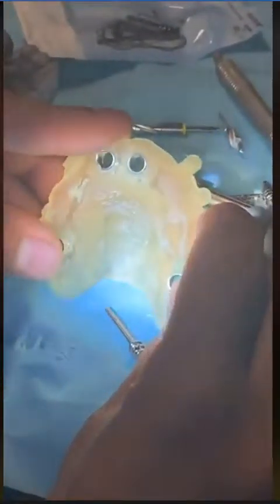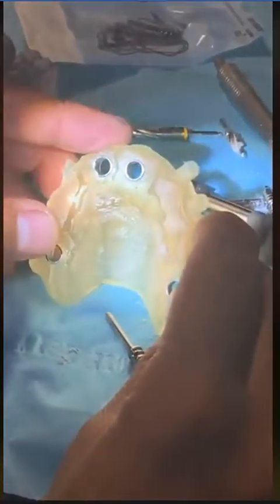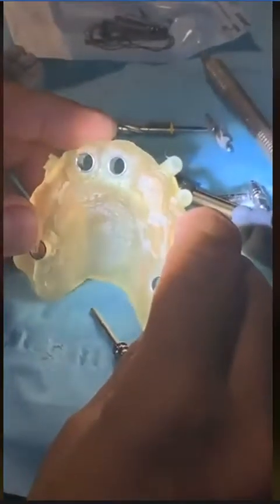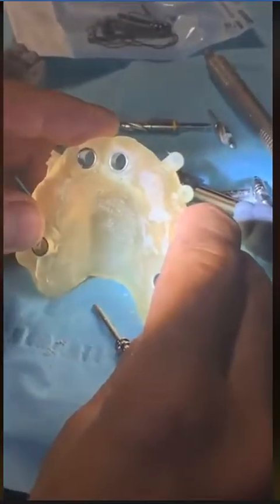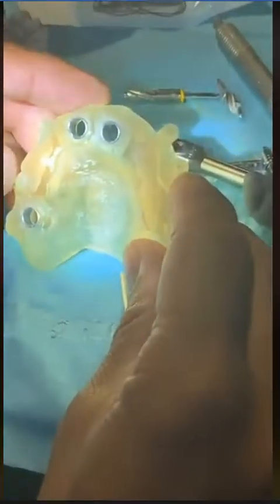Basically what we did was we took the patient's CT scan, where we're doing a dual scan of the patient. The patient has a marker on the denture. We take a CBCT of the patient with the denture in the mouth, and then after the patient comes down, we take the CBCT of the patient's denture alone on its own, and then we can merge these two entities together. So let me show you now on the computer what exactly I mean, and then I'll show you some photographs of the surgery. It's not organized really yet, but I will show you that.